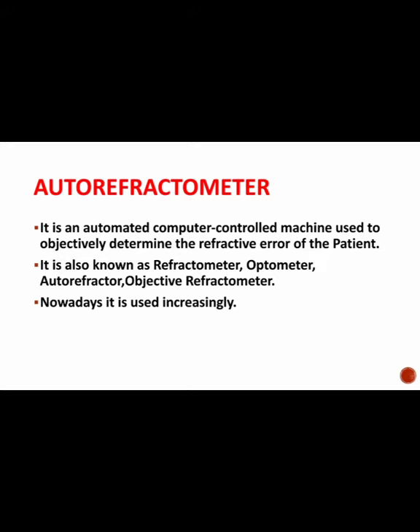Autorefractometer is also known as refractometer, optometer, autorefractor, and objective refractometer. Nowadays autorefractometer is used increasingly.